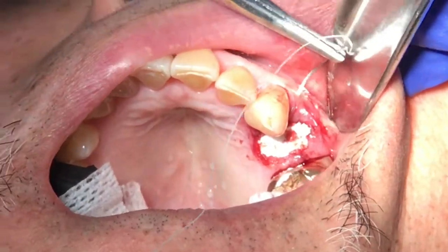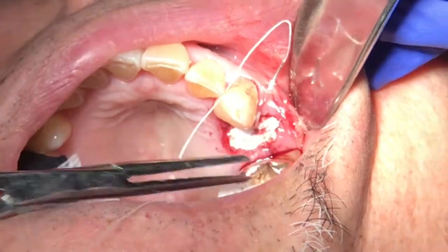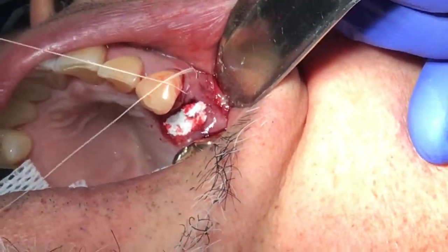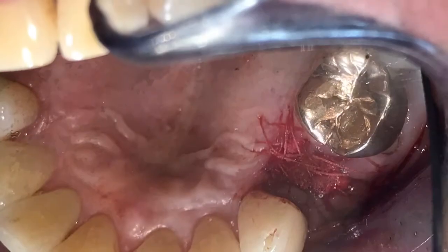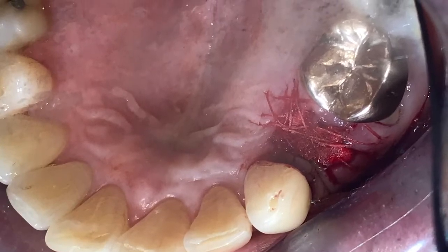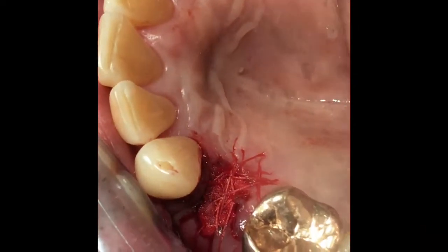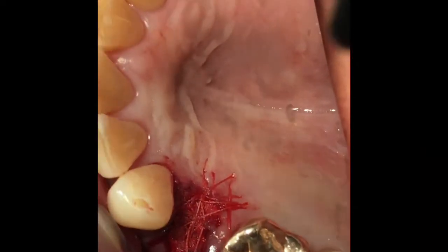Since I do implants regularly, when I see a tooth with more than nine millimeters of root, I'm pretty happy. Typically I want to go back and place the implant within about three to four months if possible. I don't want to wait too long because bone resorption will occur when you have an empty space. As you can see, the suture is done.